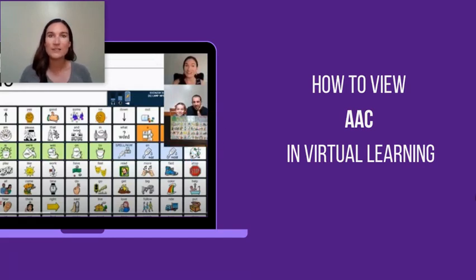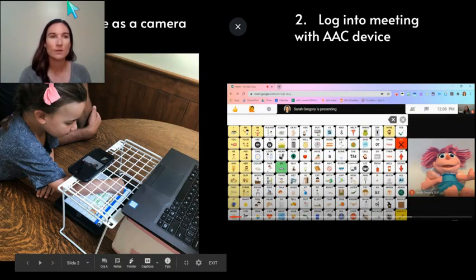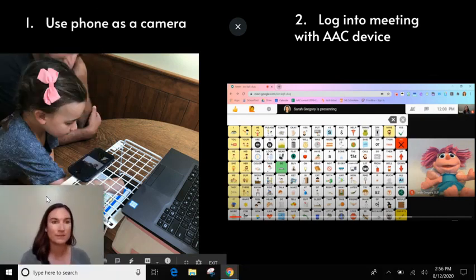So I decided to do this video because a few months ago now I was chatting with Christine Bodden from AAC for the SLP Facebook group, and we talked about how valuable it is to be able to see our students' system when we're doing teletherapy, but it also can be a little bit clunky to set up. So I'm hoping that these visuals make it a little bit easier, give you some ideas for how to do that. So we're going to look at two different options in this video.